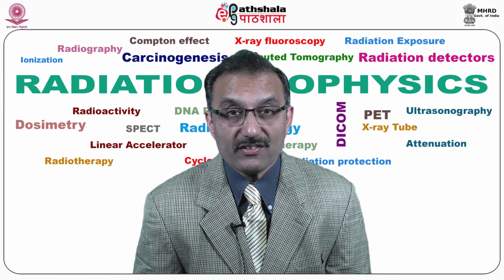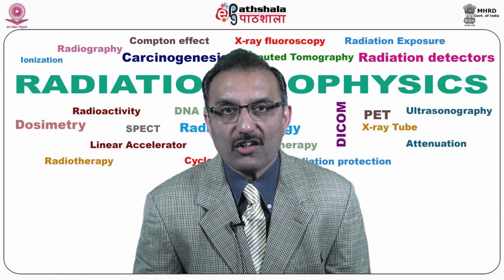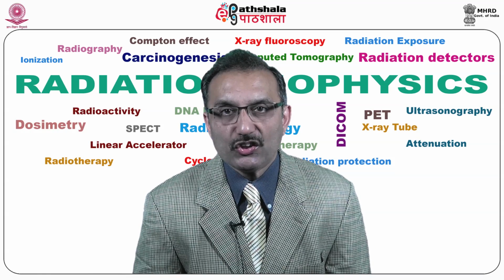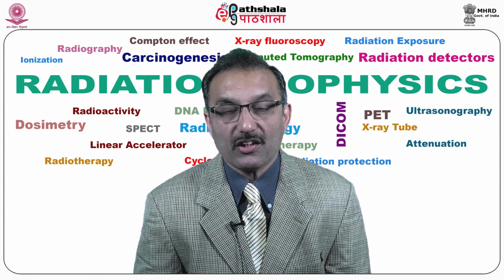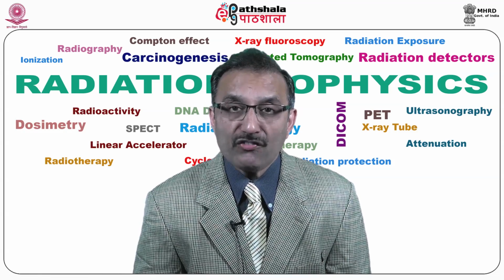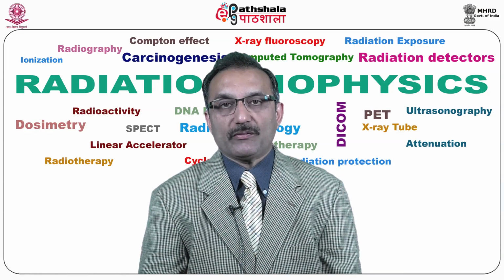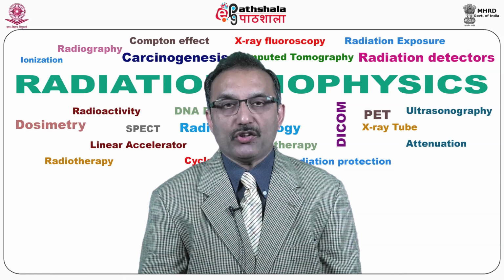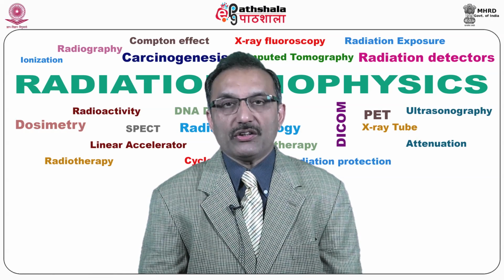Again, the radioactive substance may expose radiation to the fetus in patients who are pregnant, or to the infants of women who are breastfeeding. The risk to the fetus or infant should be considered in relation to the potential information gained from the result of the PET examination. If you are pregnant, you should inform the PET imaging staff before the examination is performed. For any nuclear medicine examination, if a woman is pregnant, she has to inform the staff before any radioactivity is administered, because it may pose some kind of risk to the fetus.